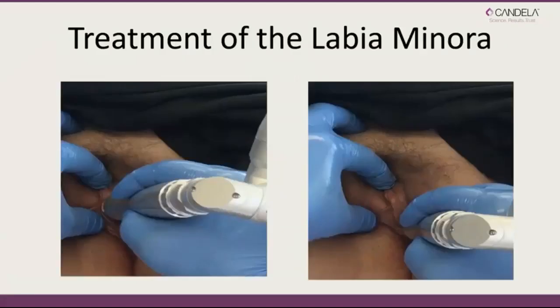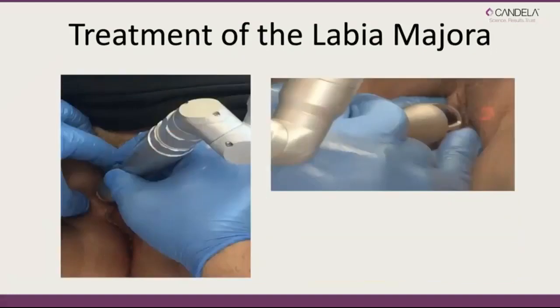And here we can see treatment of the labia minora, again, a resurfacing. And we can customize and individualize that for the patient. For any of you who are performing fillers to this region, that's another emerging indication for rejuvenation. The way I do this is I use the Co2re Intima first of all for the resurfacing and remodeling of the tissue. And I wait at least 1 month afterwards, and then we can inject fillers to the labia majora or the labia minora. And this is a wonderful combined treatment where we are addressing the different modalities of aging, postmenopausal syndrome, post-childbirth syndrome in this region.